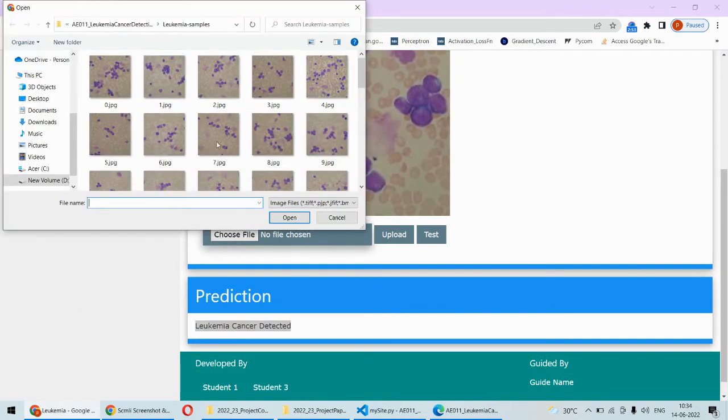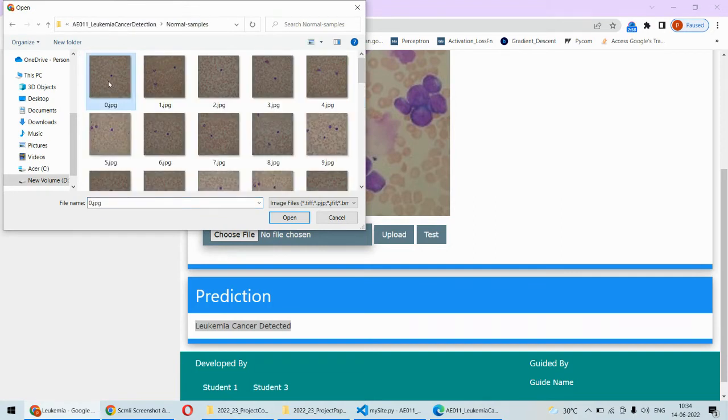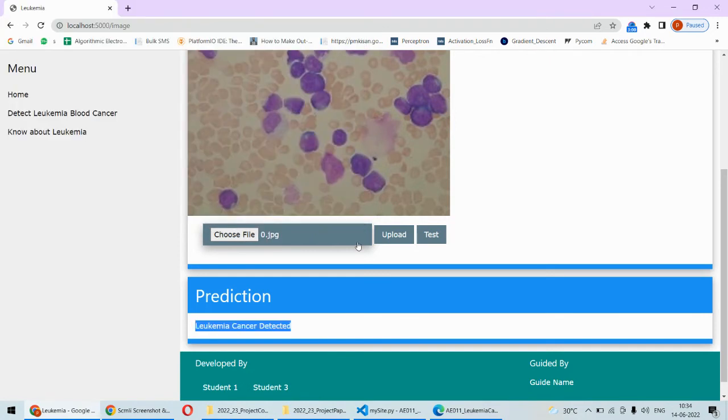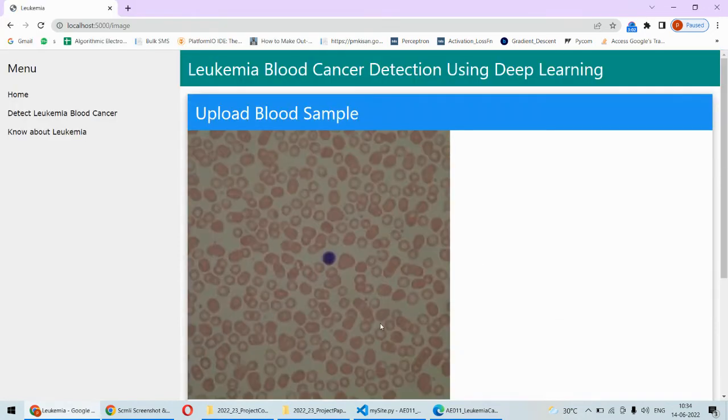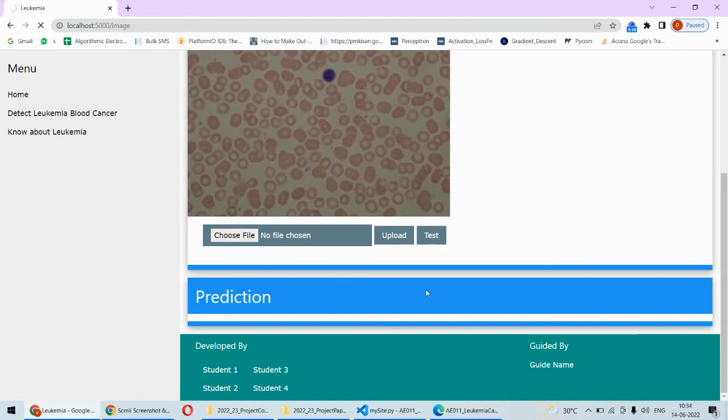For another image, we will check it out from the normal samples, and then this is the normal image. If we upload that image, it will appear here, and then if I click on test, we will be getting the results as a normal or non-cancerous blood sample.